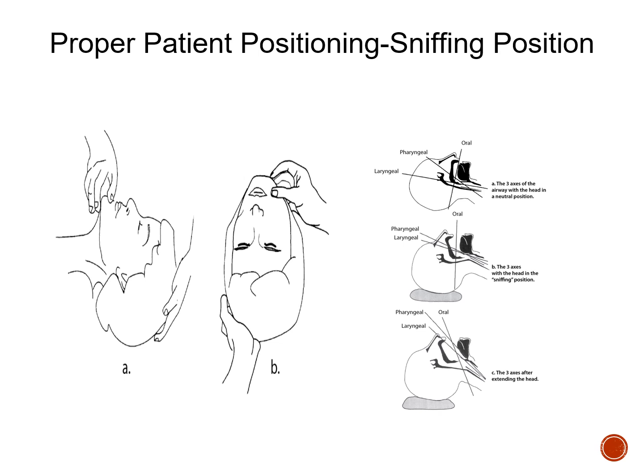The exception to the sniffing position would be if a patient has a neck injury, or a kyphotic neck, that patient who perhaps you take the pillow out from under their neck and their head stays elevated above the pillow. You need to be very careful. You don't want to dislodge vertebrae that have been previously fused, things along those lines. So it's just something to be mindful of.